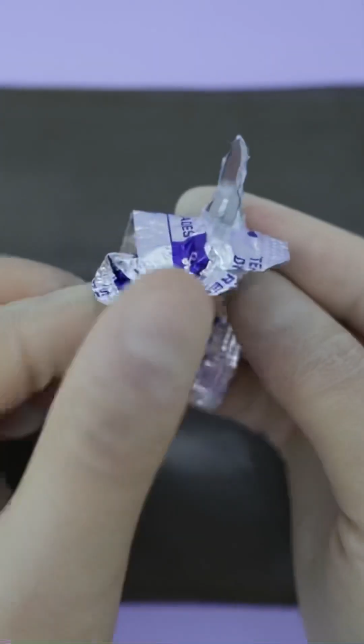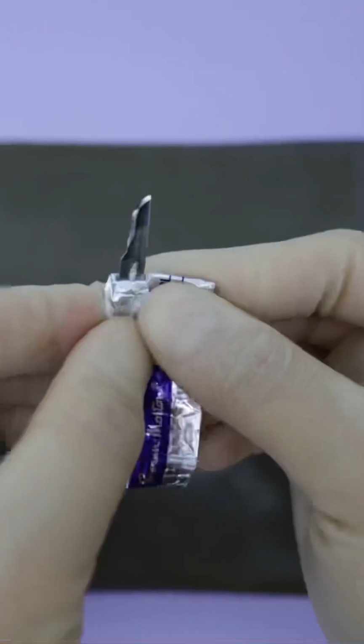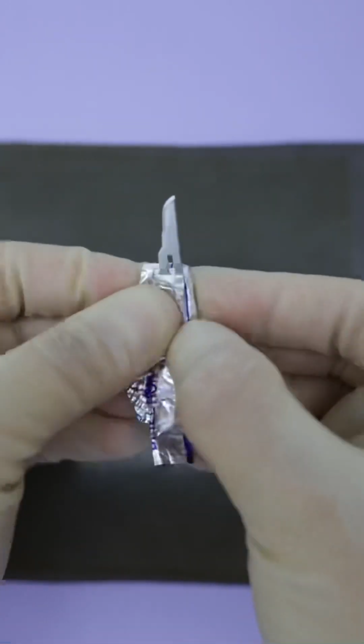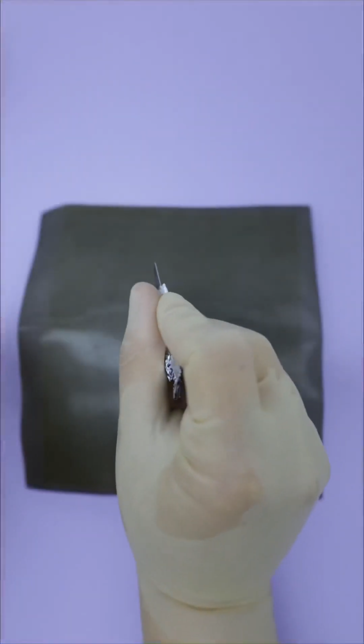Then push the tip of the blade out of the packaging material and fold the packaging on either side of the blade. Make sure to squeeze the packaging really tightly around the blade so it doesn't have any room to wiggle inside. And there you have it, a handle you can even hold in pencil grip.